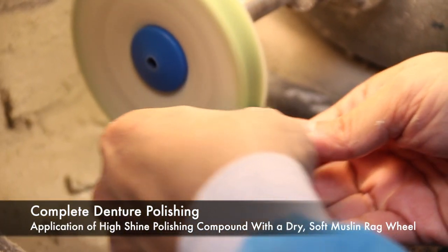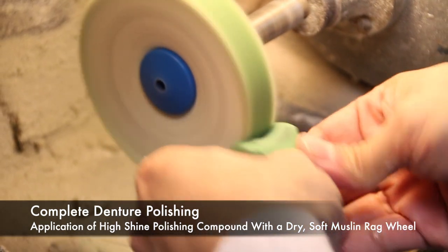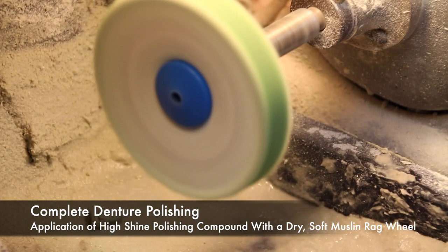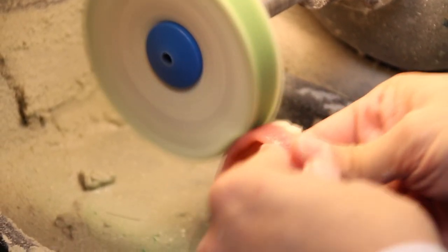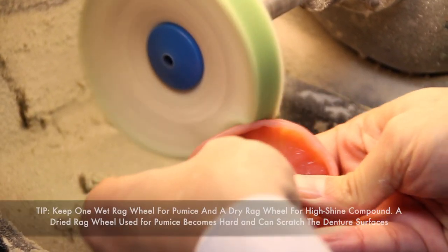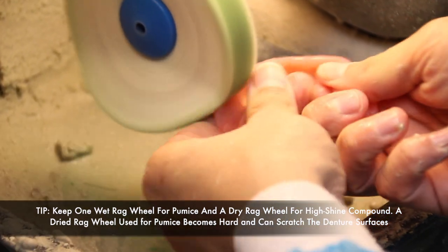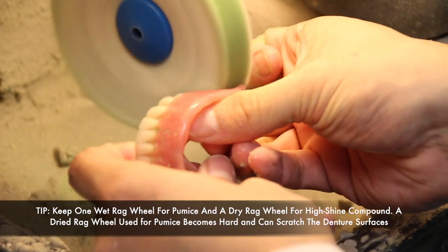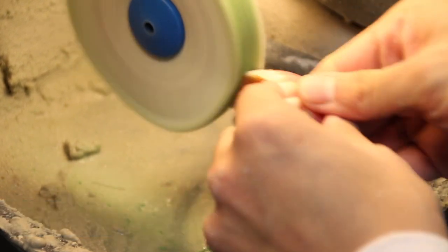The next step is the application of a high shine polishing compound with a dry, soft rag wheel. Polishing compounds are usually applied directly to the rag wheel and then onto the denture. There are some polishing creams that can be applied to the denture first and then polished with the rag wheel. It should be noted that you should have one wet rag wheel for pumice and one dry rag wheel for high shine, as a dry rag wheel from used pumice becomes hard and if used for high shine, can scratch the denture surface.